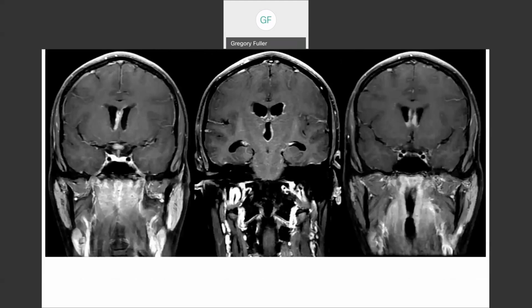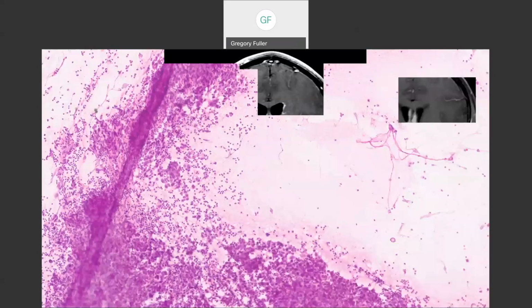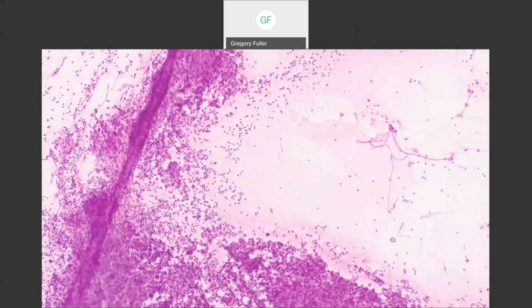This is what we're talking about in terms of additional data, additional imaging characteristics. It's not just anatomic location. Okay, the bottom line is with all that prominent contrast enhancement, this is likely dissemination. Okay, let's go to the histology.